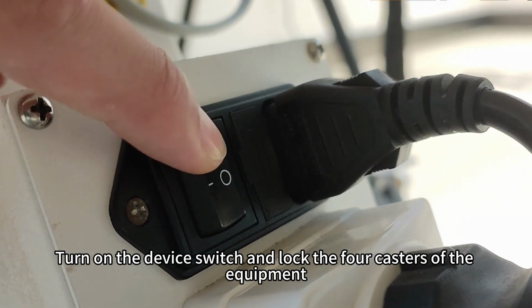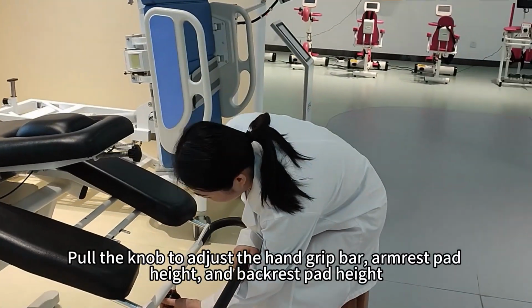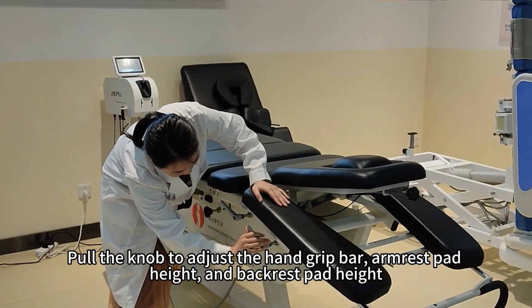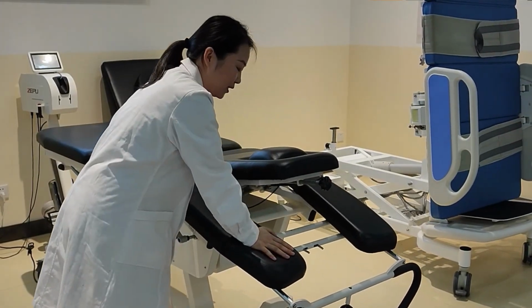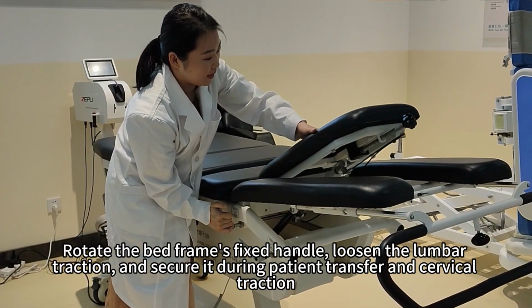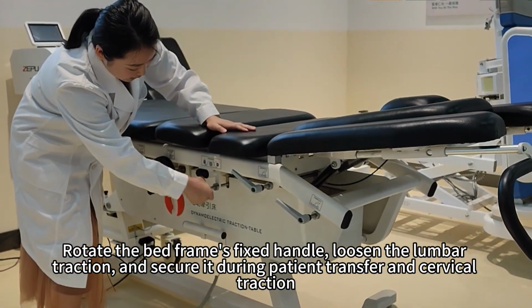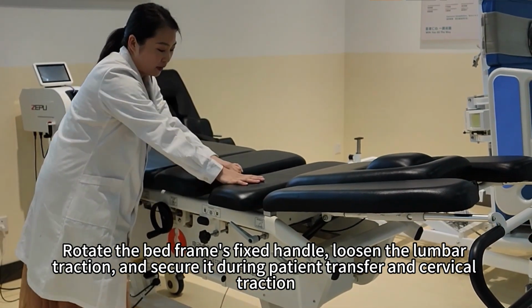On the device switch and lock the four casters of the equipment. Pull the knob to adjust the hand grip bar, armrest pad height, and backrest pad height. Rotate the bed frame's fixed handle, loosen the lumbar traction, and secure it during patient transfer and cervical traction.